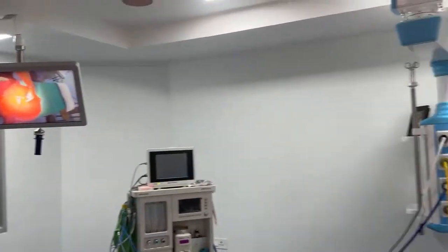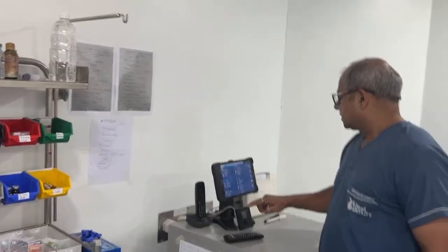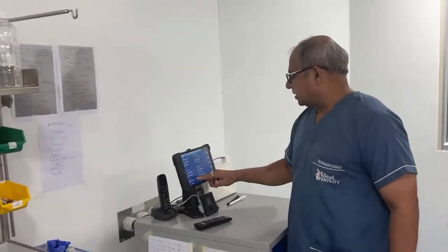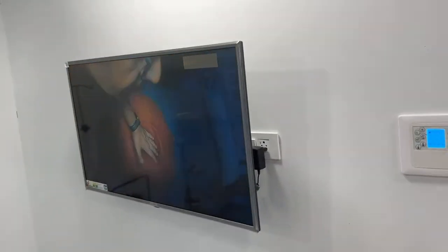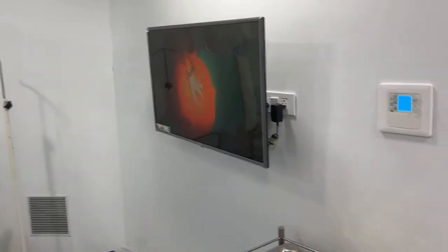If I want to take this to that screen, again I can remove the endocam and the OT light can be transmitted to the large screen, and you can see the large screen is working again, which is the secondary screen in the operation room.